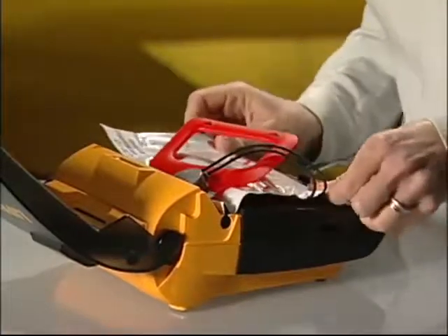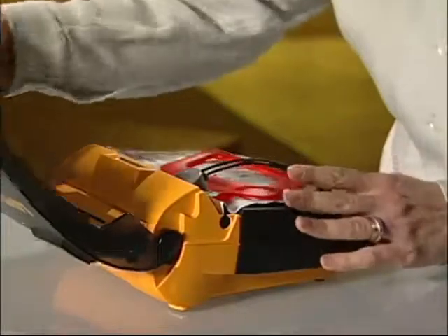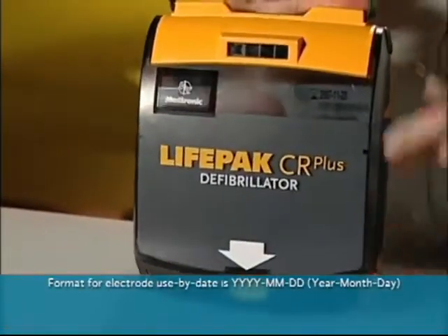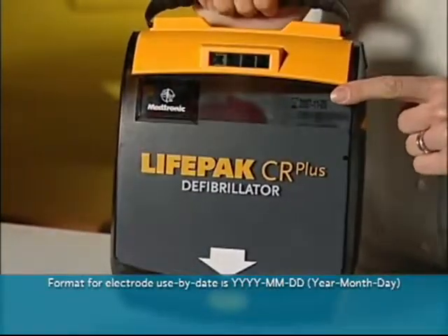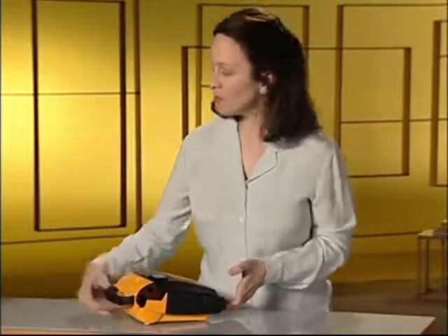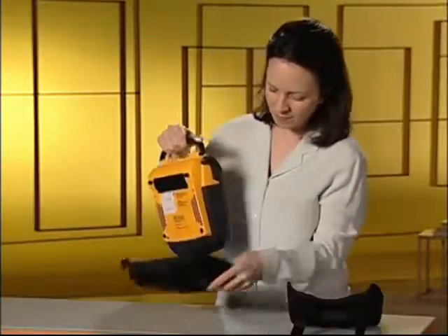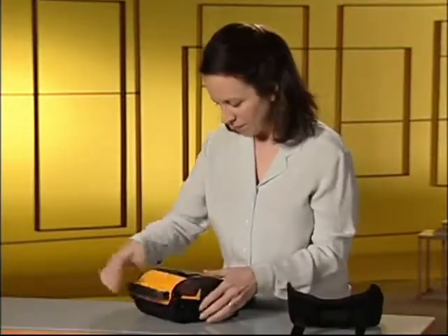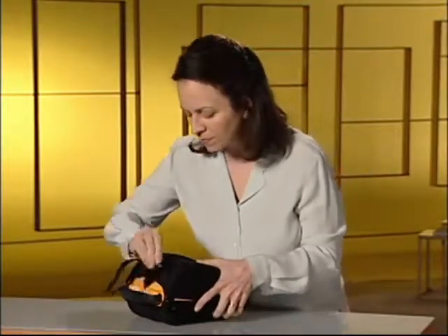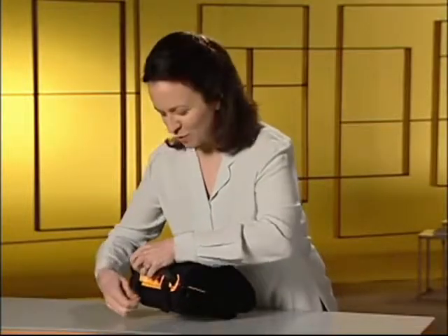Center up the package and tuck the edge under this little lip here so you can close the lid. Make sure you can see the new use-by date through this little window again. And there, all done. Some Lifepak AEDs come with a soft case. Put it on like this. It closes with these Velcro straps.